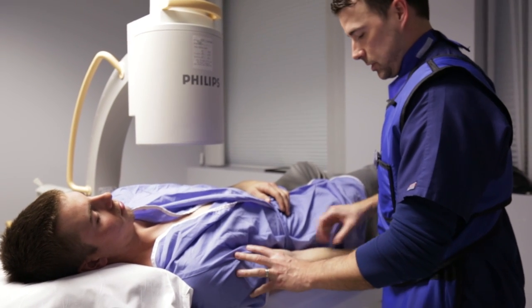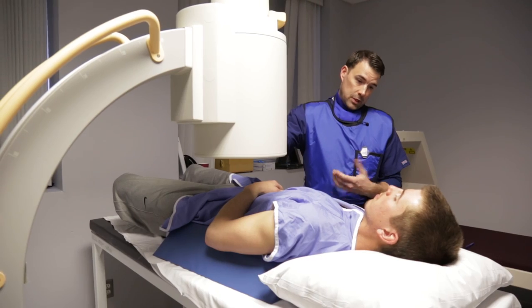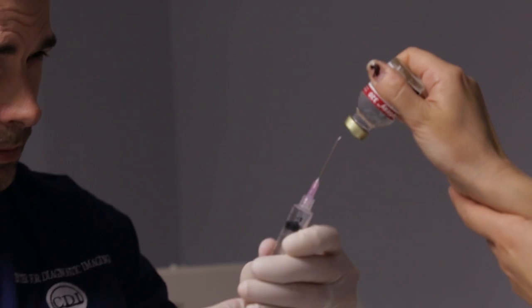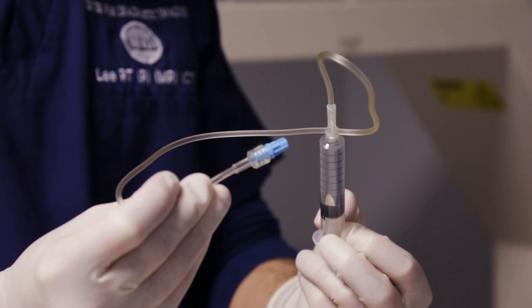When Matt Pierry's shoulder injury started getting in the way of his job, his doctor sent him to CDI for an arthrogram. One of the reasons we do arthrograms is because when we inject fluid into a joint before we do an MRI, we get a lot of additional information about the joint, especially the lining of the joint and the structures that hold and support it, like the labrum in the shoulder and the hip. Those are things that we wouldn't see as well if we didn't have fluid in the joint ahead of time.